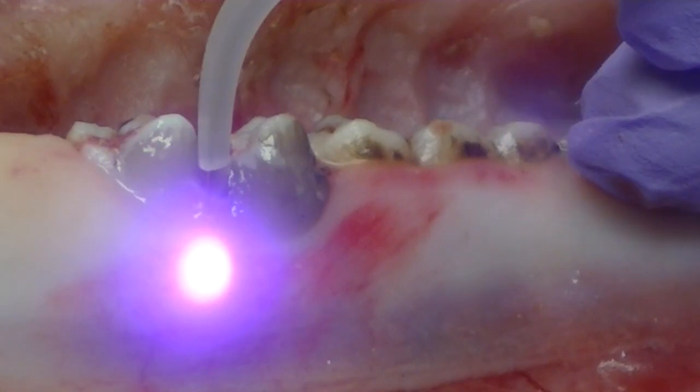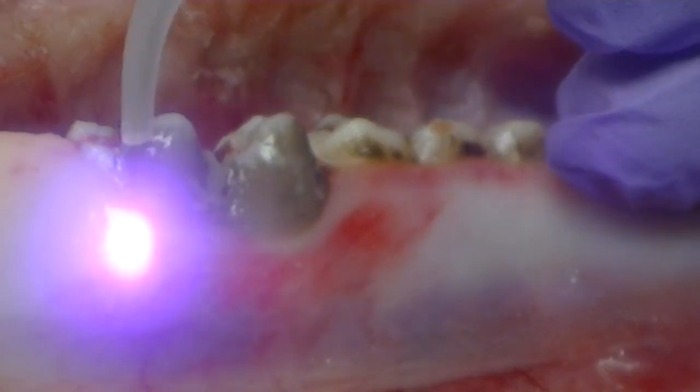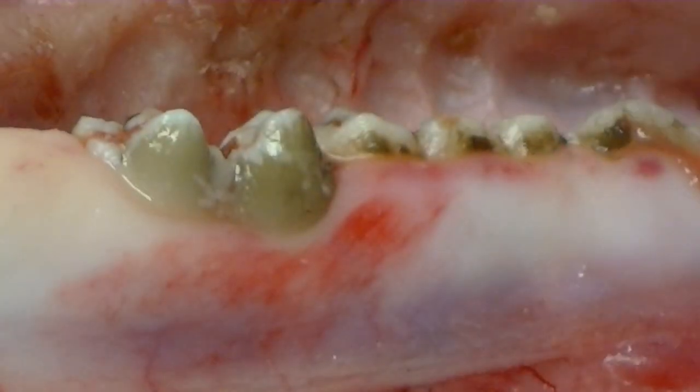That's typically what happens — whether I want to or not — when that tip becomes self-initiated and I end up pulling out a ball of dead tissue on the end of my tip.